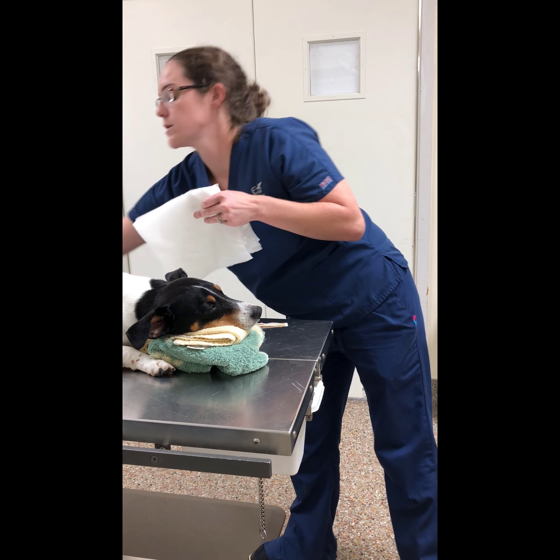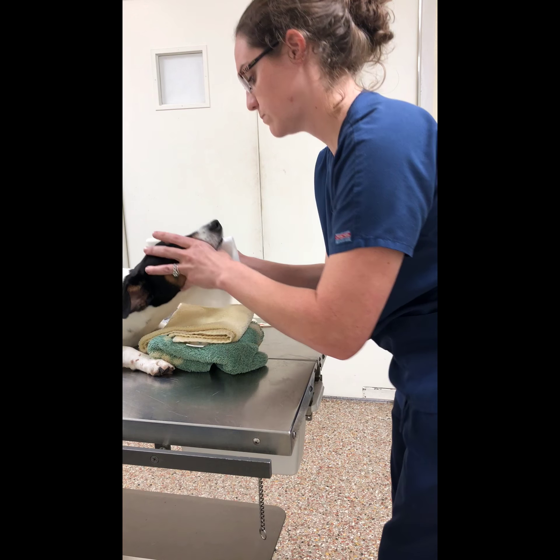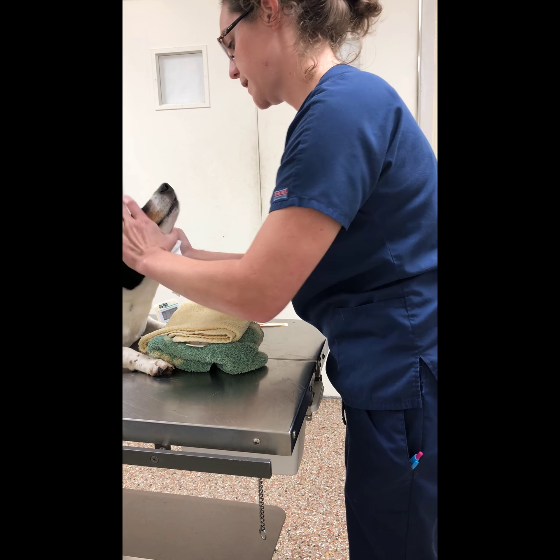Then I'm going to use a paper towel just so that we don't get stain everywhere, and flush it out.